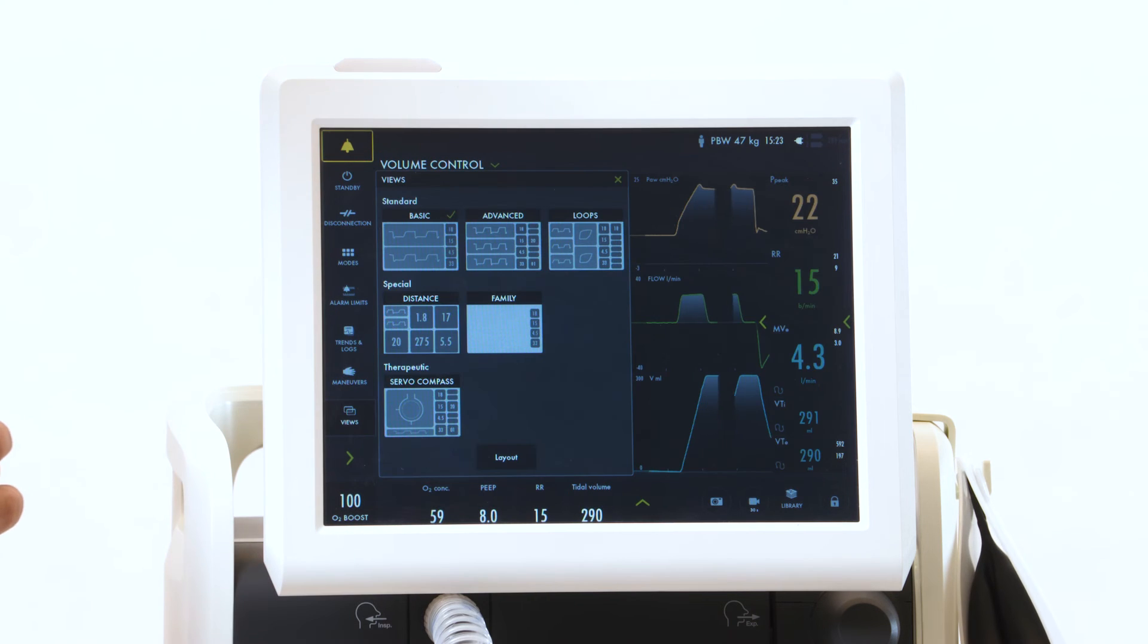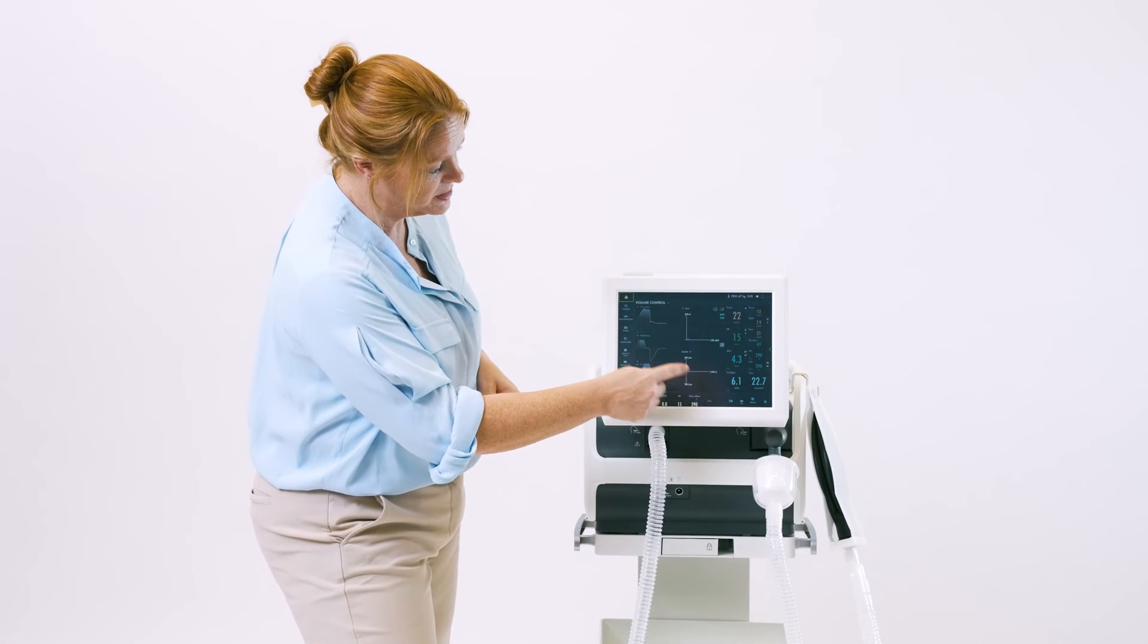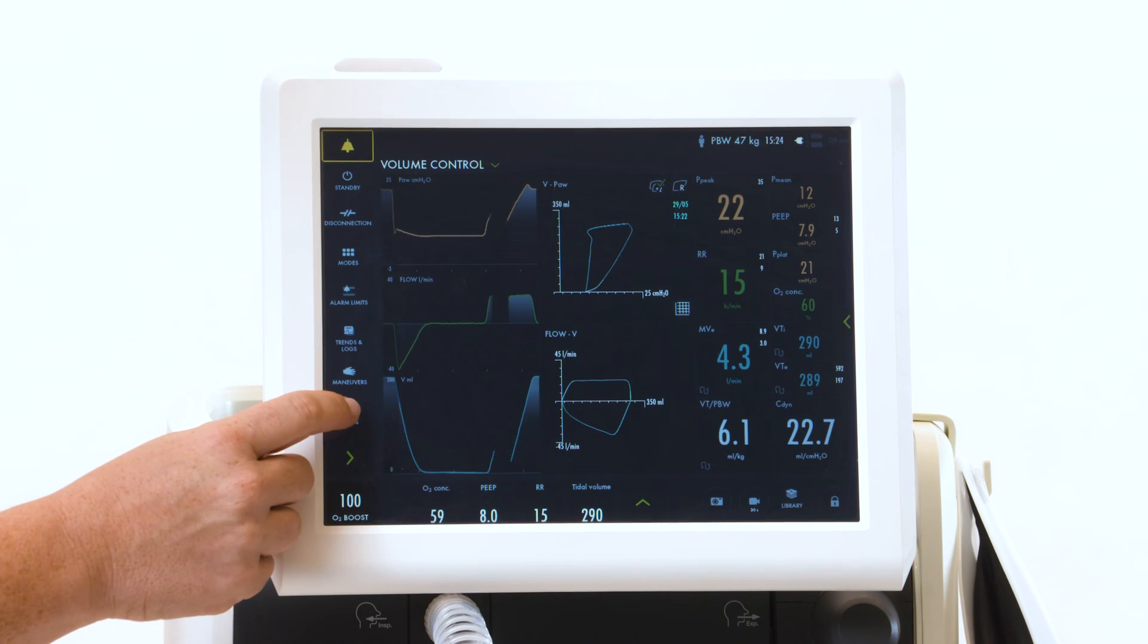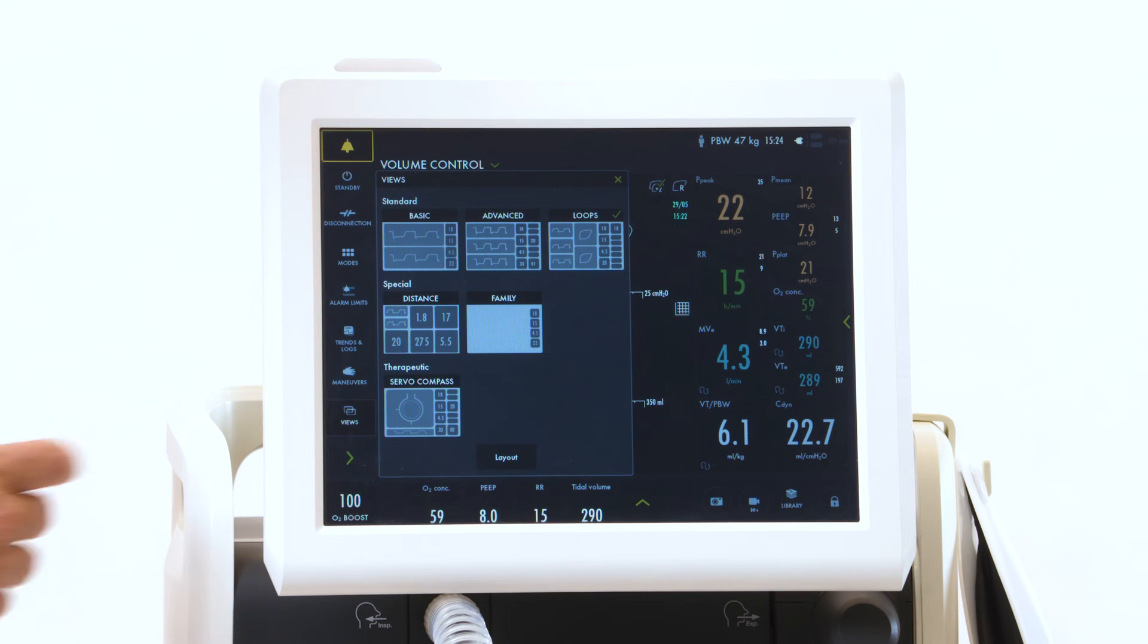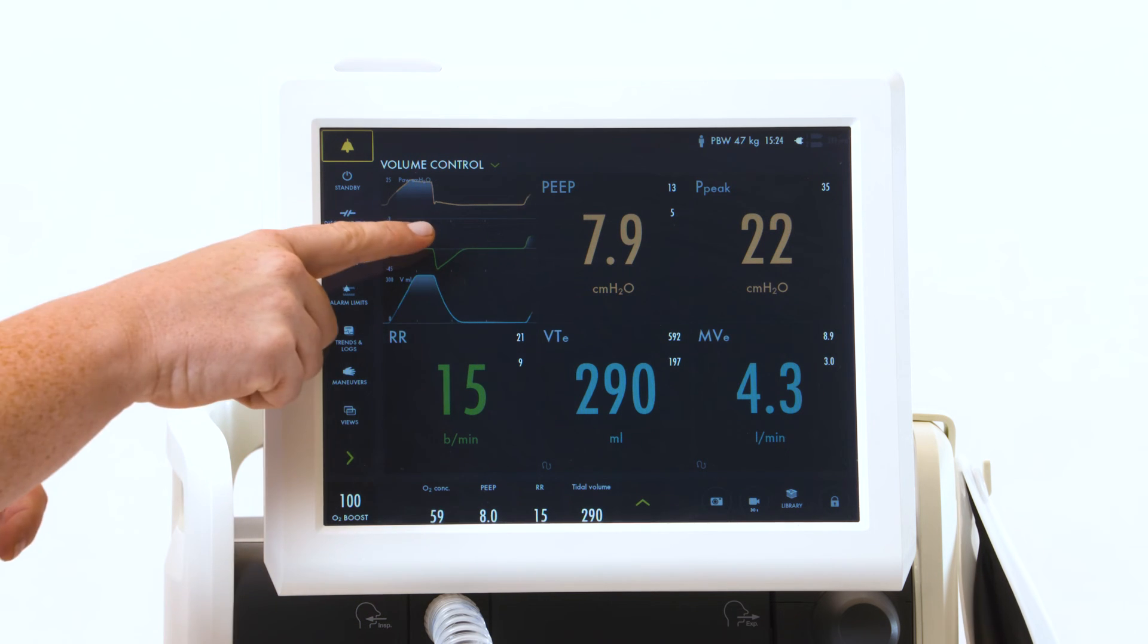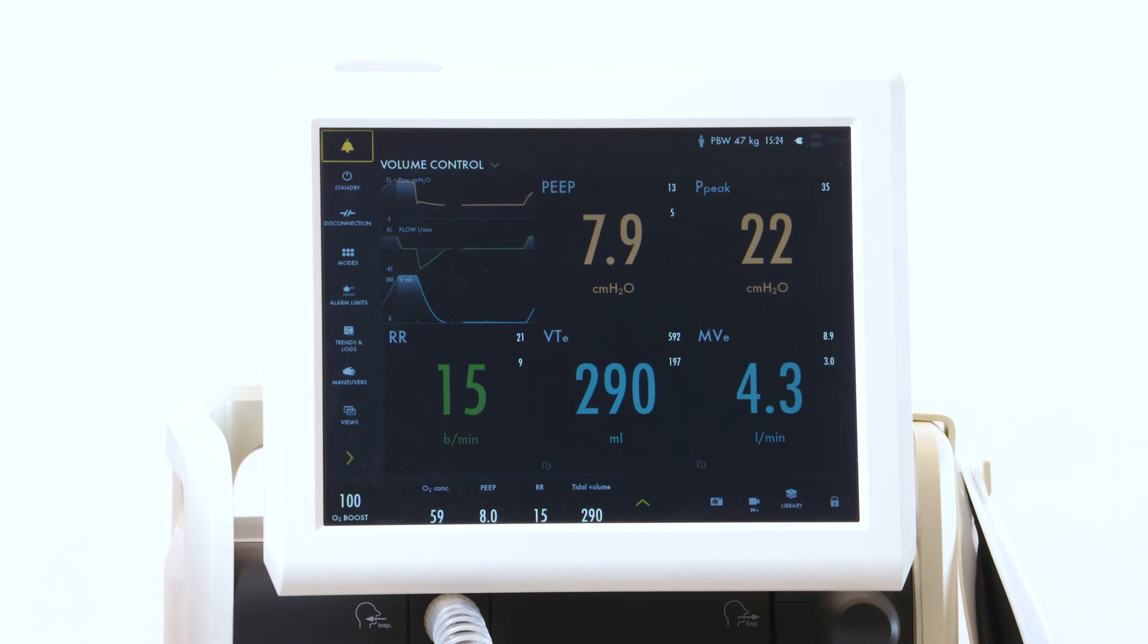Looking again at your views, you have a loop screen. Your loop screen will show your loops, which you can also have reference loops. Note it up here. Just touch to activate. When you look at your views again, there's a distance view. It will show you five basic measured values, as well as your pressure and flow waveforms.